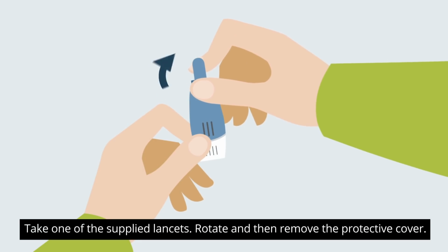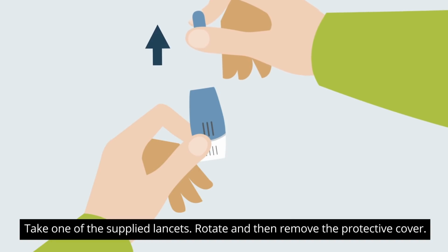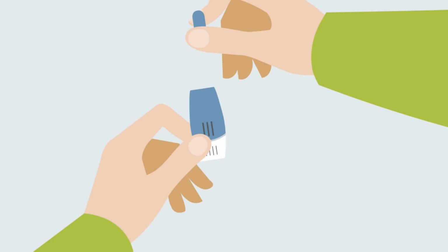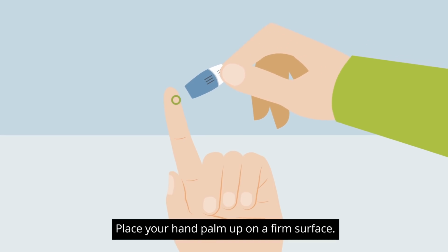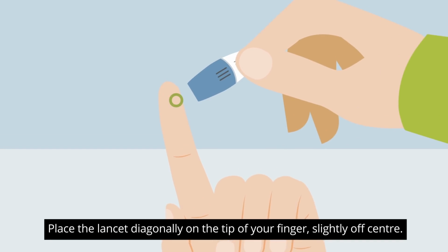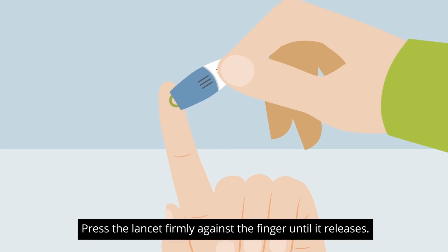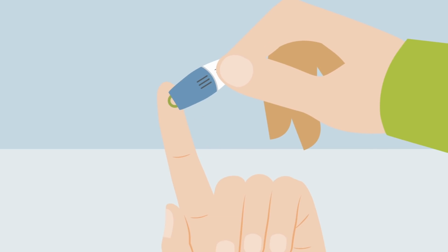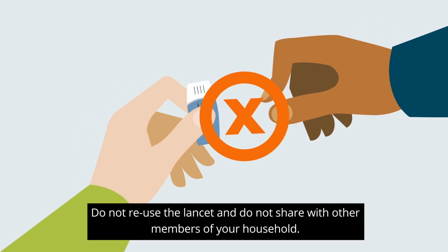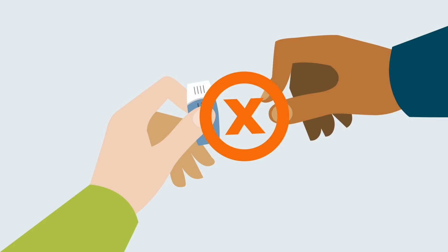Take one of the supplied lancets. Rotate and then remove the protective cover. Don't use a lancet with a loose or missing protective cover. Place your hand palm up on a firm surface. Place the lancet diagonally on the tip of your finger, slightly off-centre. Press the lancet firmly against the finger until it releases. Do not reuse the lancet and do not share with other members of your household.